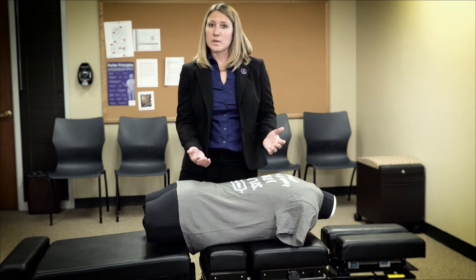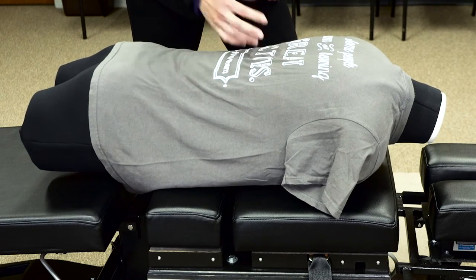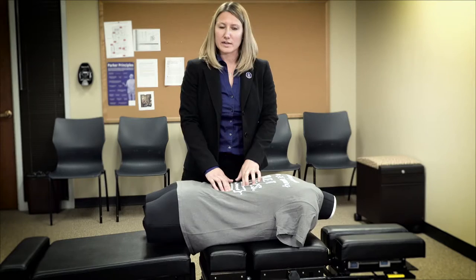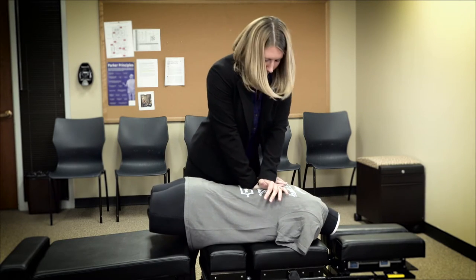When students come into this room, everyone wants to palpate the mannequin. The mannequin has a full spine, has a skeleton in it, so everyone tries to find where everything is. Then you come in, you take your contact, you lean over your patient, and you deliver a thrust.